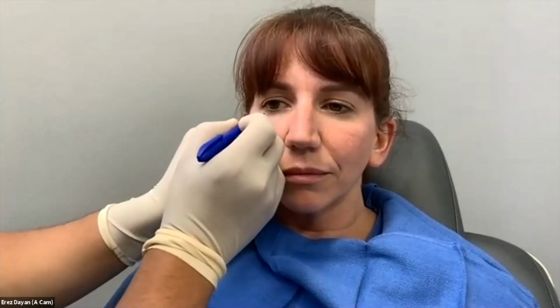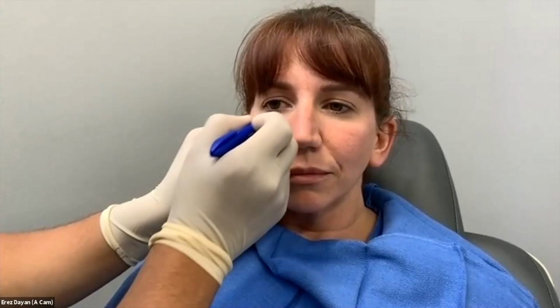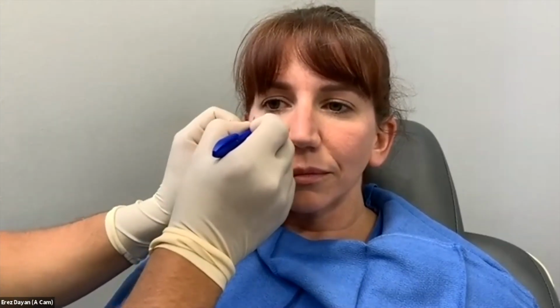I would make a little wheel of 1 cc lidocaine here with a 27 or 30 gauge needle. I would come in with that tumescent fluid, about 10 cc's of it, with a little bit of a larger needle, maybe a 16 gauge, right on the periosteum. And when you're in the right plane, the whole SOOF will just kind of fill up with 2 cc's, not even. So that's really where you want to focus. So here's the tarsal plate. Here's the orbital rim. So I want to be right in between here. That's usually just the width of an Accutite.